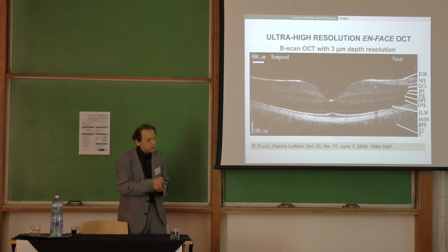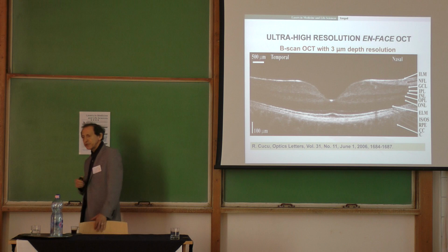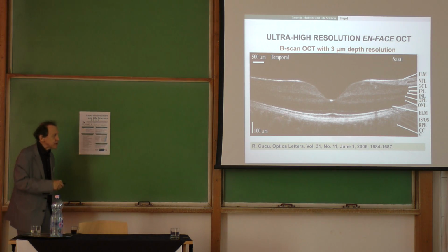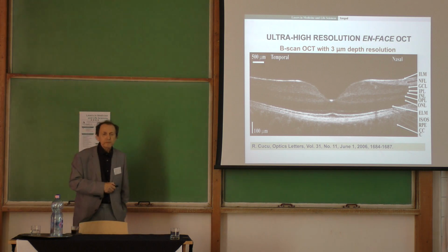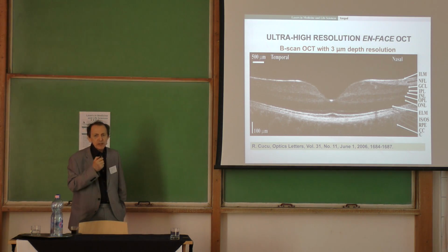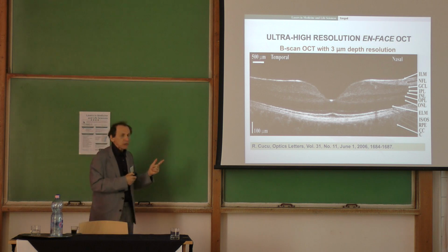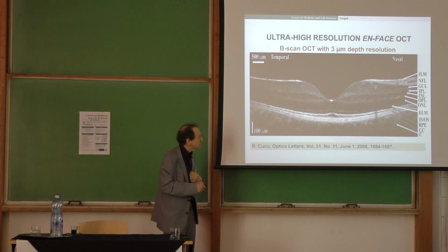So now ophthalmologists who are not engineers, not technicians, they regularly measure the thickness here with micron resolution. So you realize clinicians now went into that specialty instantly, patient by patient. They could tell you with accuracy of micron how thick is that layer. As well as you can see many other layers, and they all mean something here.